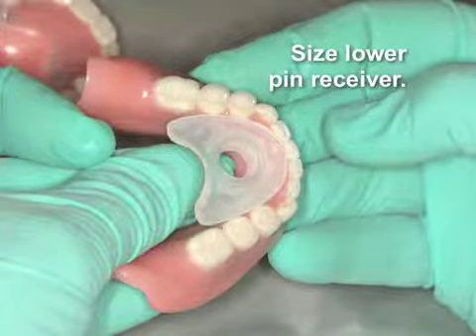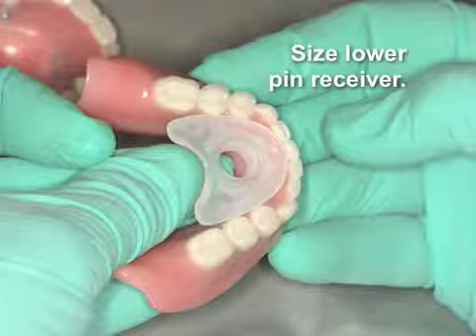Now we will size the lower pin receiver. It may be necessary to take a burr and customize this to fit so that nothing engages the tube structure.